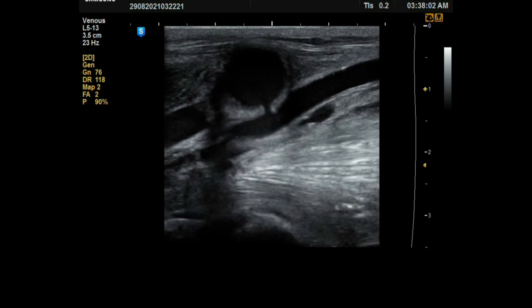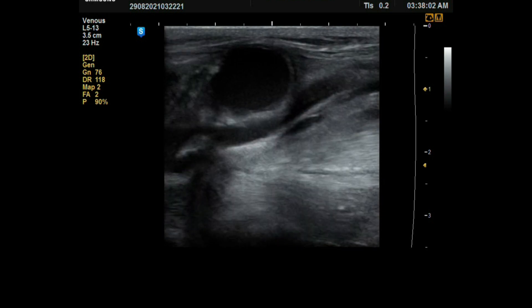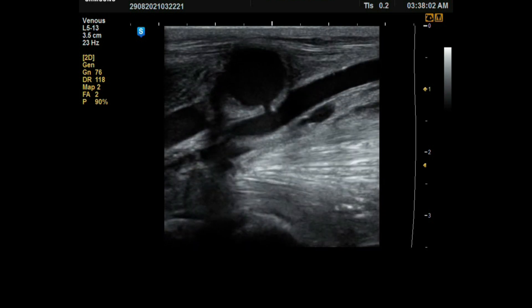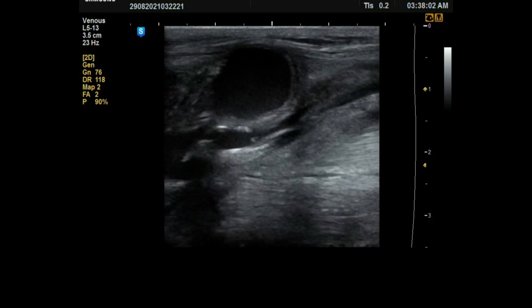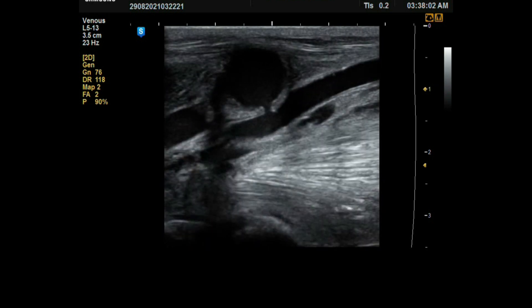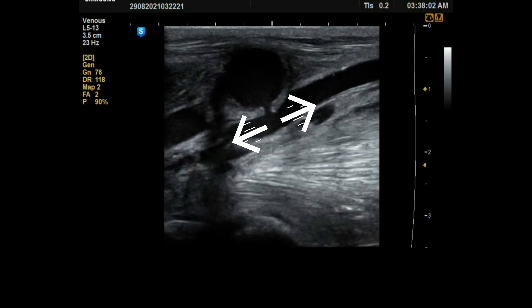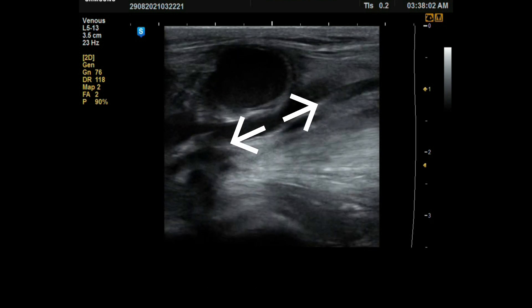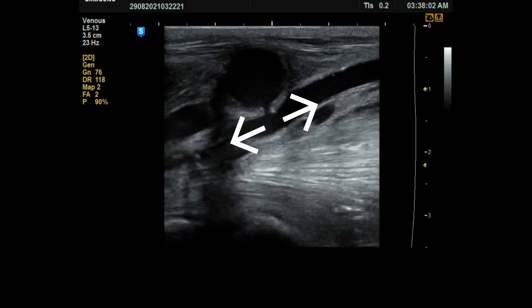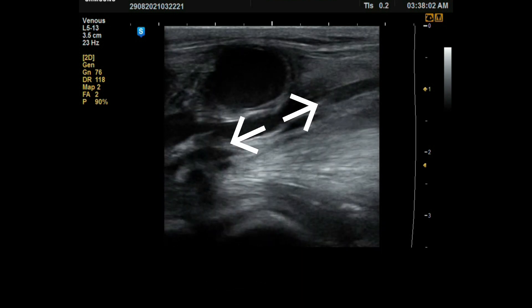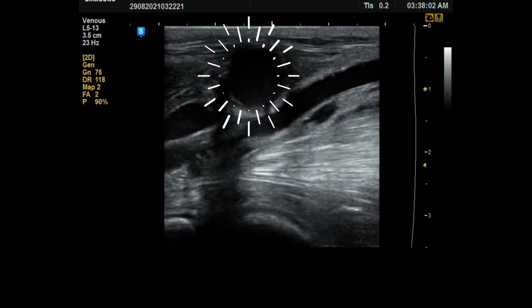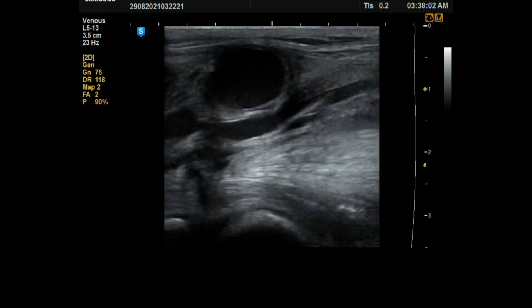Ultrasound was done for assessment of the fistula, and when we scanned the brachial artery over the pulsatile mass, we found this out-pouching connecting to the brachial artery through a neck.